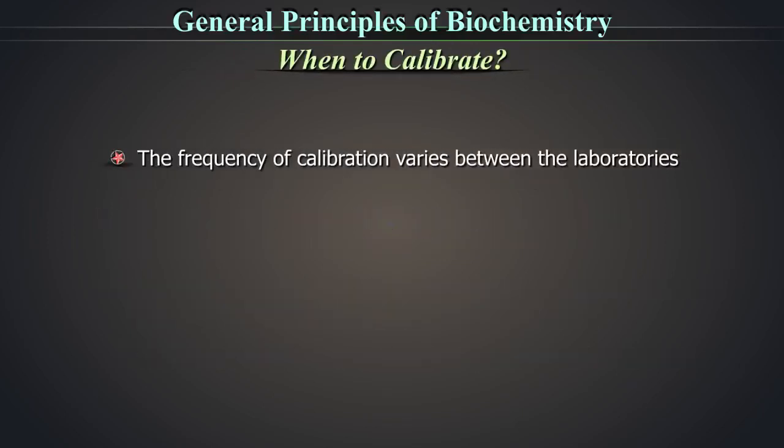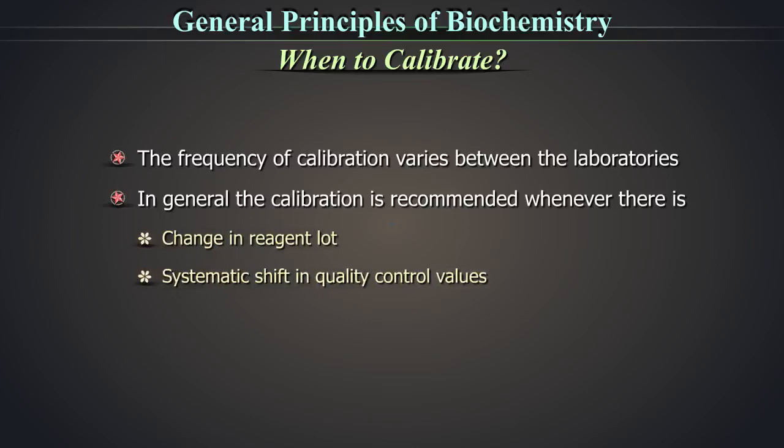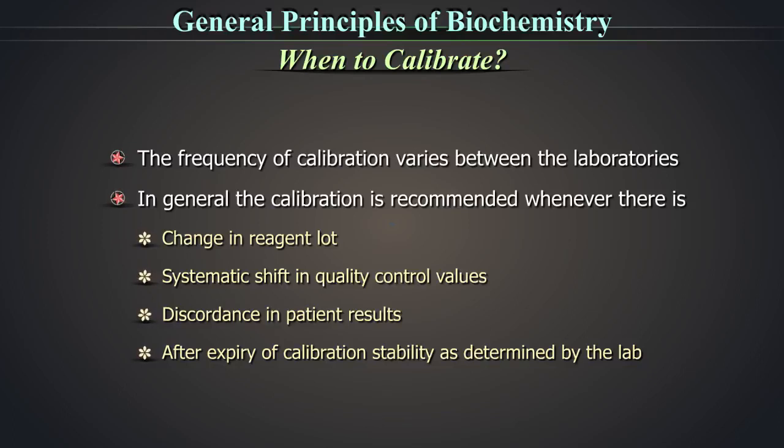When to calibrate? The frequency of calibration varies between laboratories. In general, calibration is recommended when there is a change in the reagent lot, a systematic shift in quality control values, discordance in patient's results, or after expiry of calibration stability as determined by that lab.